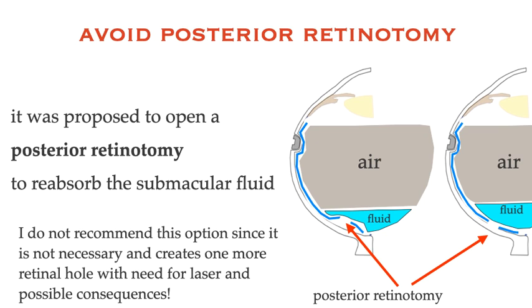It had been proposed to open a posterior retinotomy as an alternative to reabsorb the residual submacular fluid, but I do not recommend this option since it is not necessary. It creates one more retinal hole with the need of laser and possible consequences. So if you just allow it to settle down, it will be reabsorbed by the RPE and with no need of extra breaks.